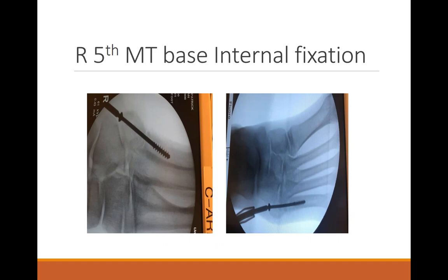I'll tell you here, it looks like the fracture edges are very, very smooth. Yeah, I think there's some peaking there too. This was actually done about 2 weeks after that initial x-ray, so that could be why. Well, you don't get smooth edges in 2 weeks. This might be longer. This smells like a stress fracture.